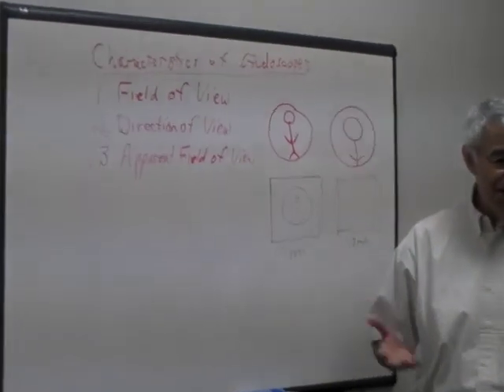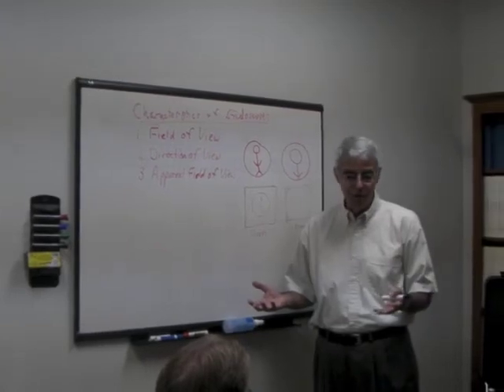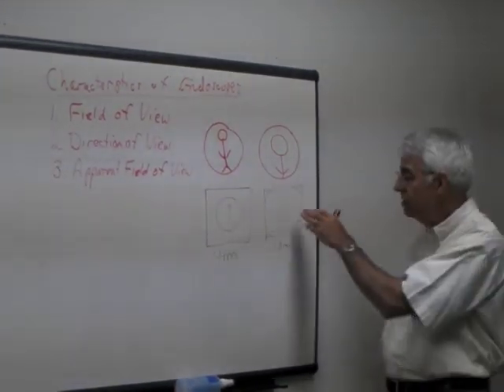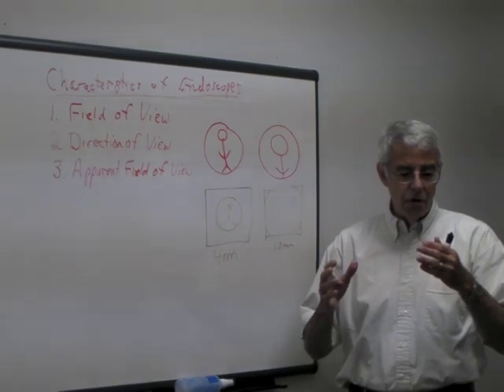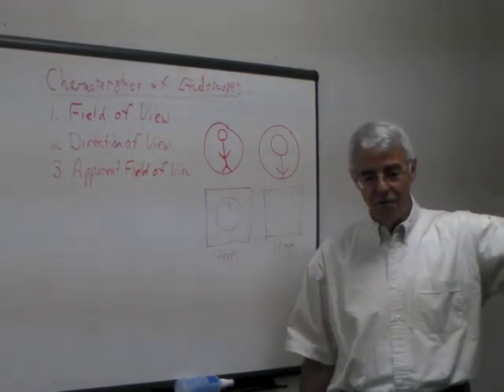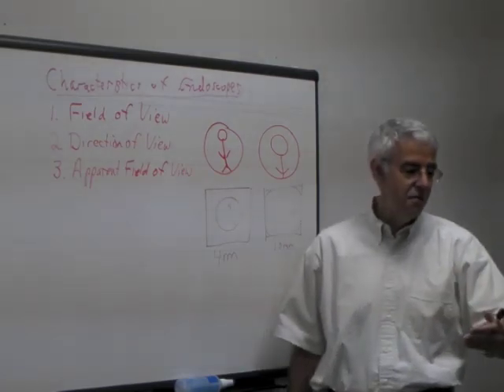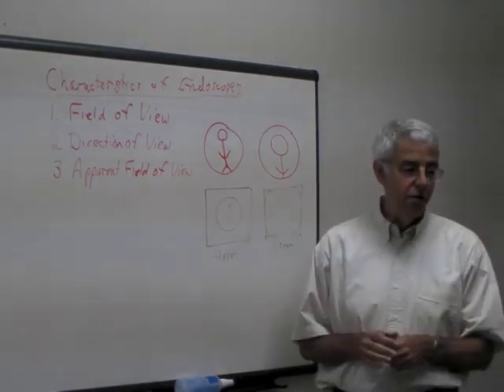So it seems to be kind of an esoteric measurement, and most people have never heard of apparent field of view, but you can see how important it is. You could say, okay, this fills half of the monitor, this overflows by 25%, but if we started quantifying the apparent field of view like that, then you'd have to say, okay, with a half-inch format camera and a 27 millimeter focal length video coupler, you have to have all these caveats and specifications for the measurement. By using apparent field of view, that's all we need to quantify the endoscope.